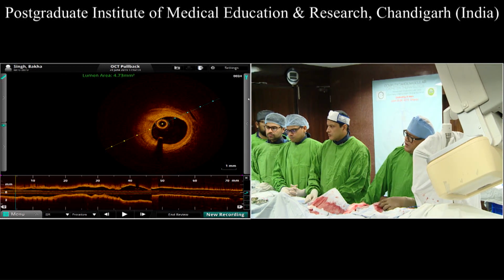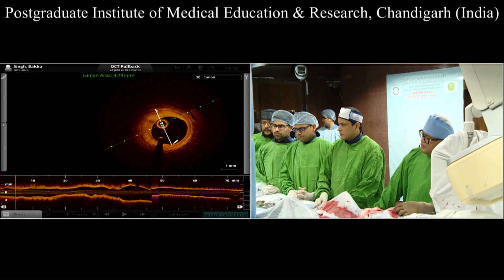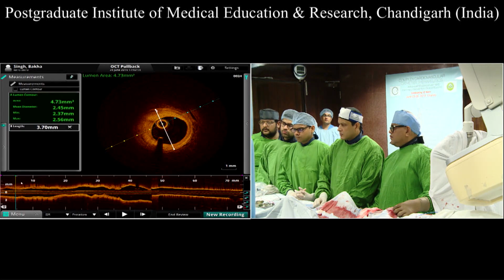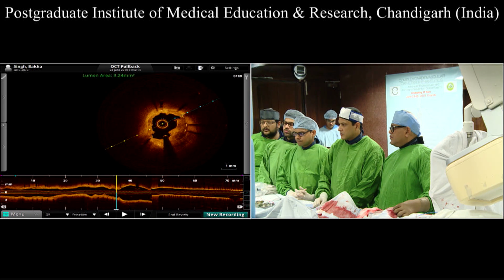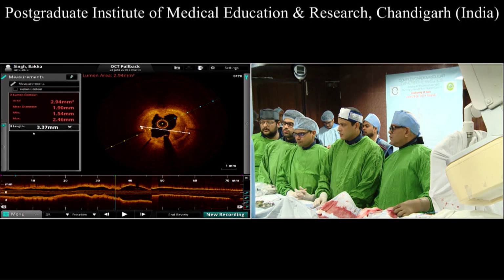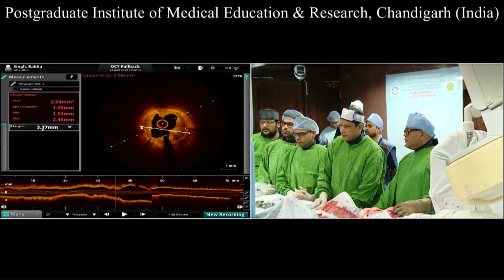I have a comment from Dr. Murasato. This stenosis is caused by proximal edge stenosis because the LAD stent has a gap to the LAD ostium. So in the proximal edge, severe intimal proliferation, and to some degree, a low intracoronary lumen area can be found.